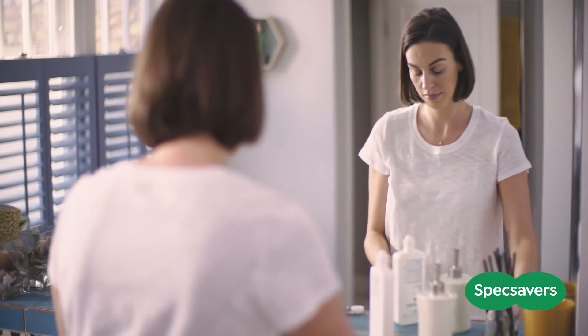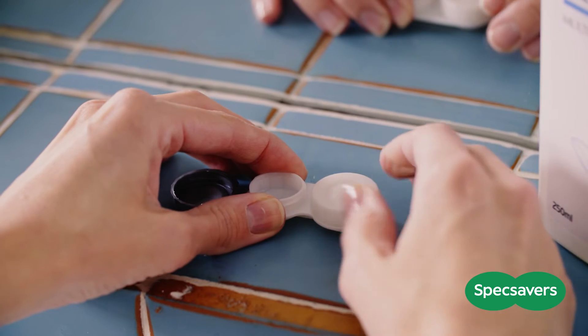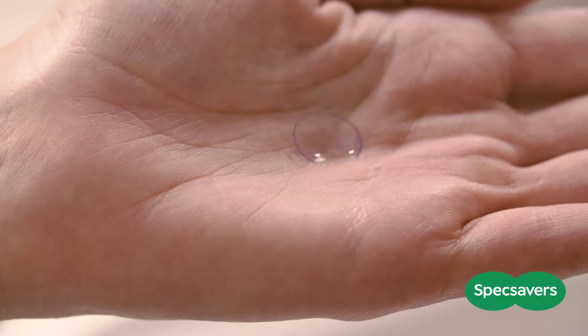If you wear reusable contact lenses, you'll need to clean them with a solution. Be sure to follow the instructions for the solution provided to you. If you're unsure about anything, drop by your nearest store and we'll be happy to help.